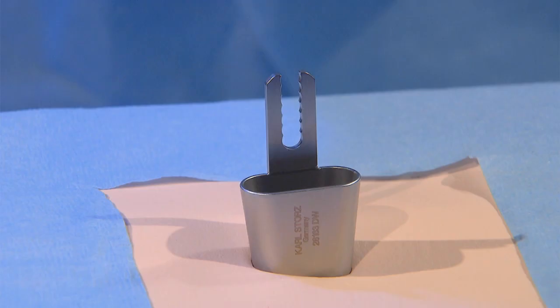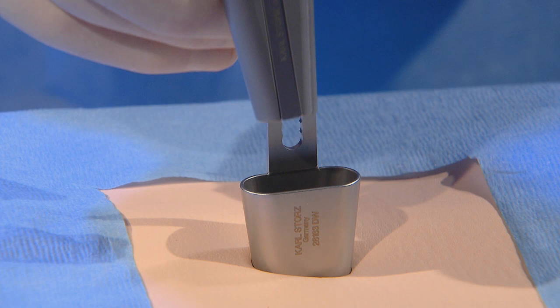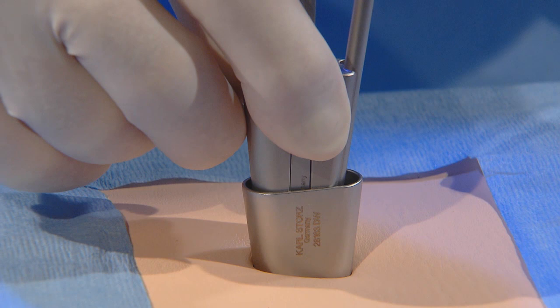The internal part is set up on the speculum and can be moved downwards, which results in a zoom effect. However, it is easier to work in the higher position, which gives a wider field of view, especially for bone resection.